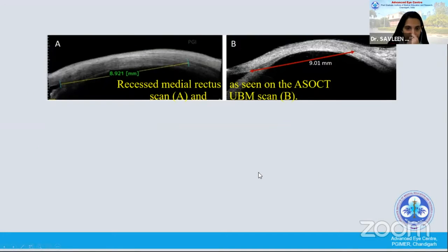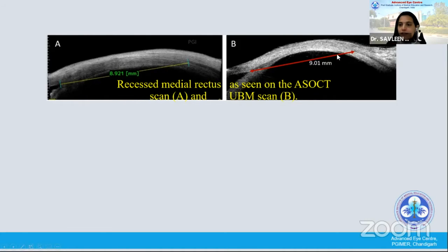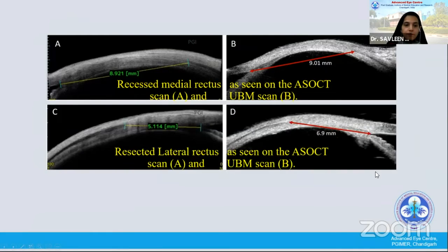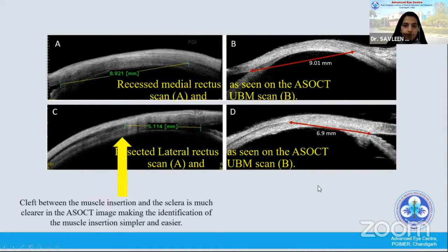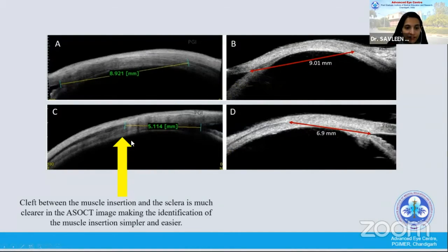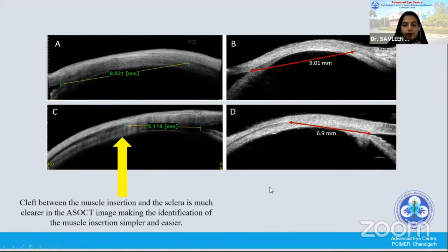On the left side, this is how a recessed medial rectus looked on the ASOCT, and on the right side this is how the recessed medial rectus looked on the UBM scan. Again, a resected lateral rectus on the ASOCT and on the right was a picture of the UBM. We can see how the cleft between the muscle insertion and the sclera was much clearer on the ASOCT, making the identification of the muscle insertion quite simple and easy.